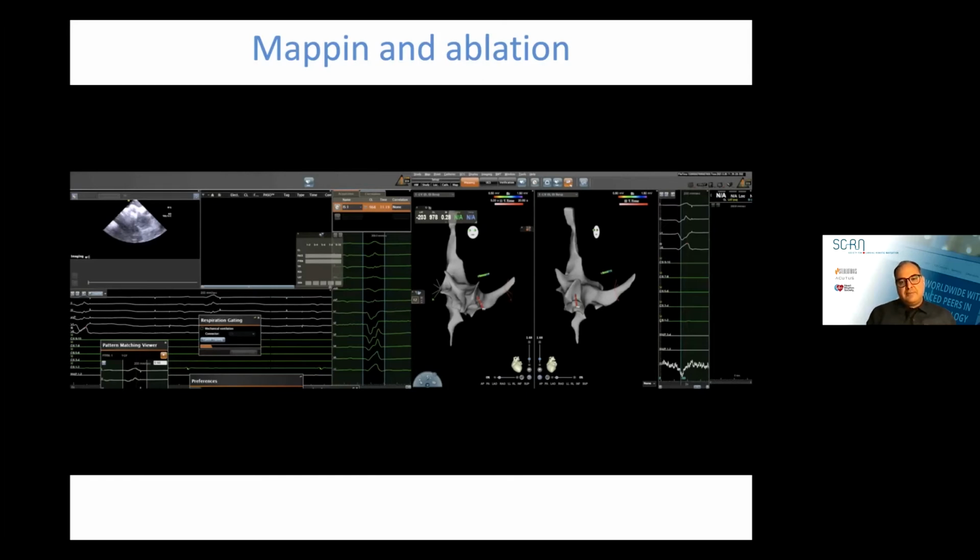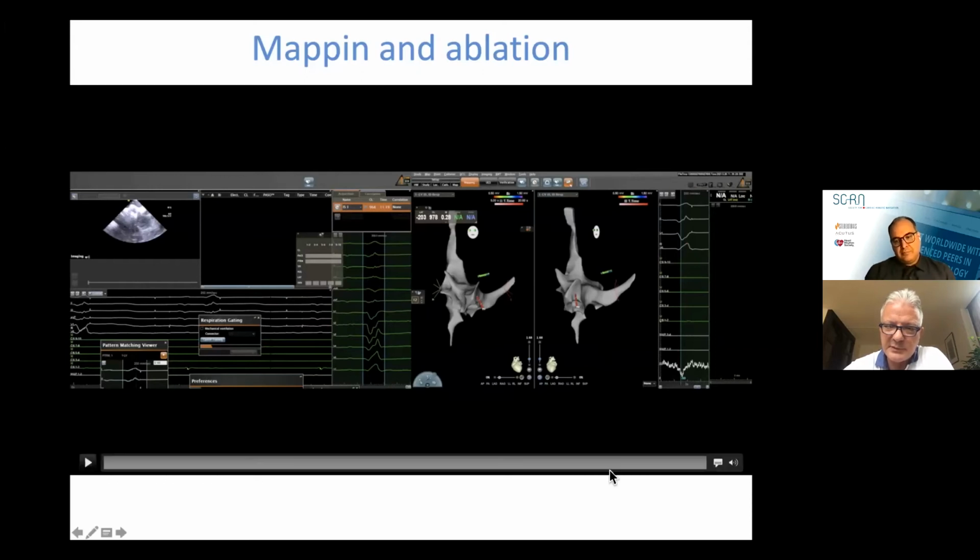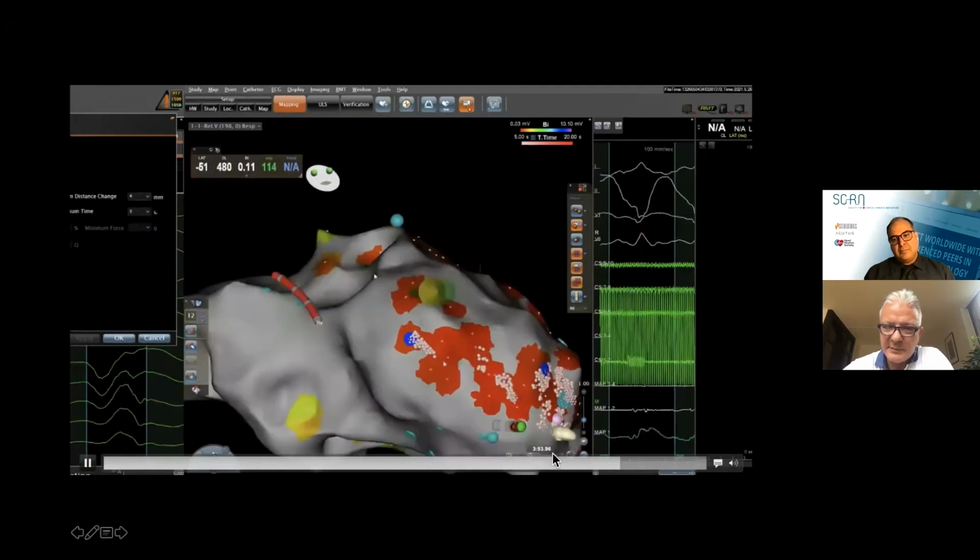Can I ask you actually the same but in a different way? From the very beginning of robotic VT ablation, it was never published this way, but in anecdotal conversation with each other, we all had an impression that when you look at the maps that you do manually, even with these diagnostic catheters, you have much better reach with remote catheters. In other words, do you ever have the feeling that with the remote catheter you have a better reach and you gain access to parts of the LV that you didn't actually map during your manual?